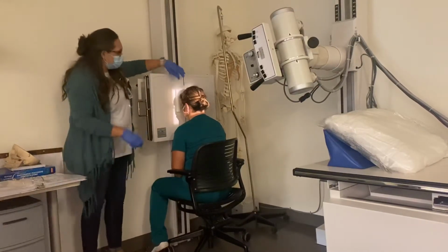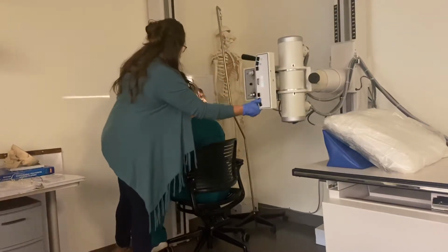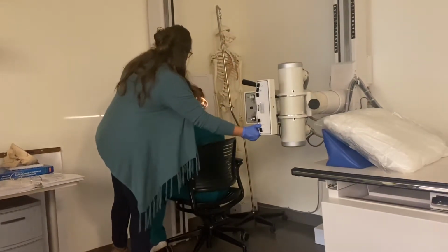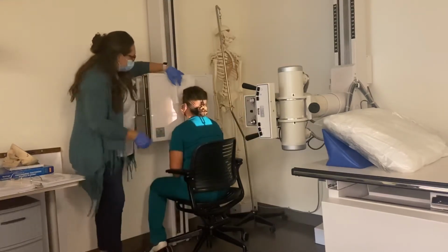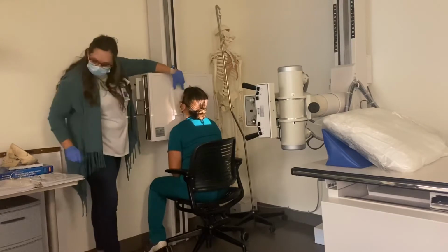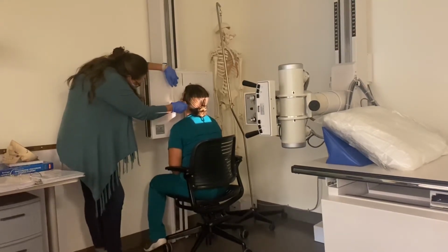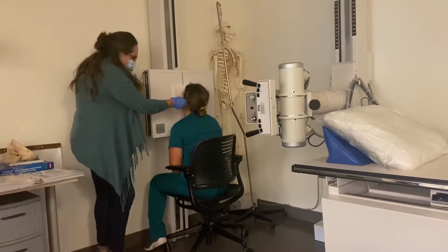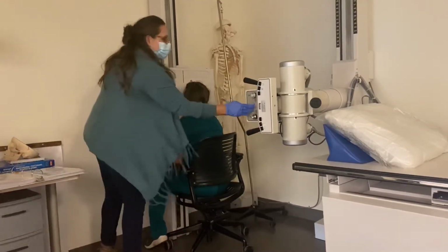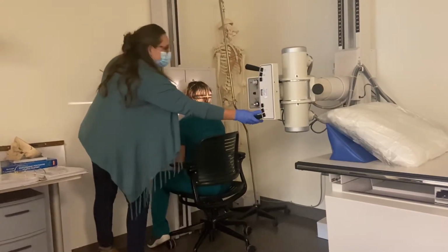After that, I'm just gonna go right into the Waters again. I'm gonna take my angle off. I'm gonna have my patient bring their chin up so their mental meatal line is perpendicular. Lean back just a little. Okay, go ahead. So I'm gonna check from the mandibular symphysis to the EAM, make sure that MML is perpendicular. Then I'm gonna come up, make sure that I'm centered exiting at the acanthion.